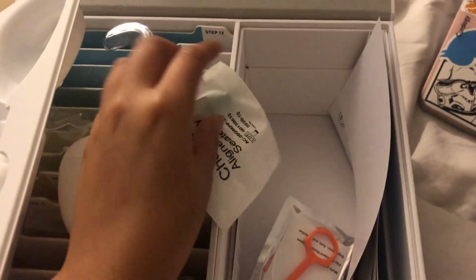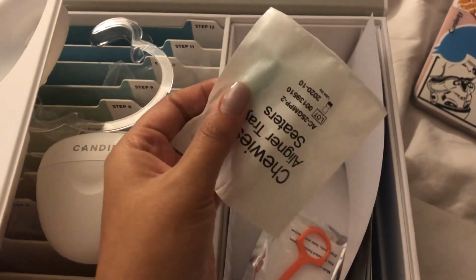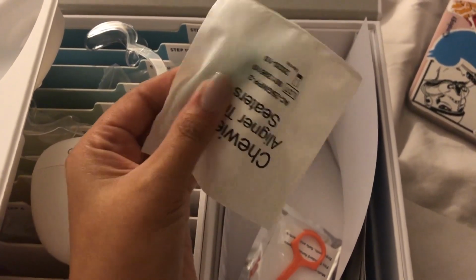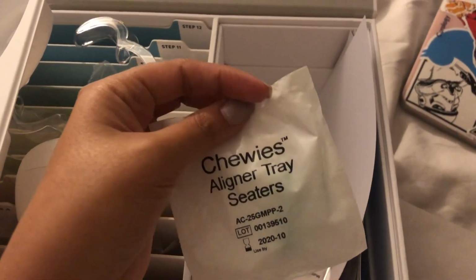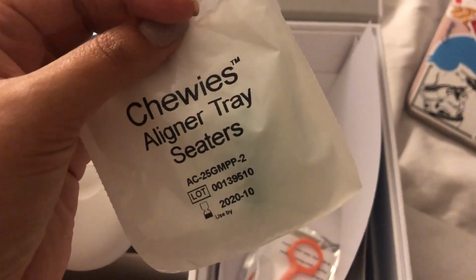And this is a pack of chewies. I have one chewy next to my bed. This is another chewy. You just chew on these to either click them into place, or if you feel pain somewhere, it's kind of like working out your teeth.